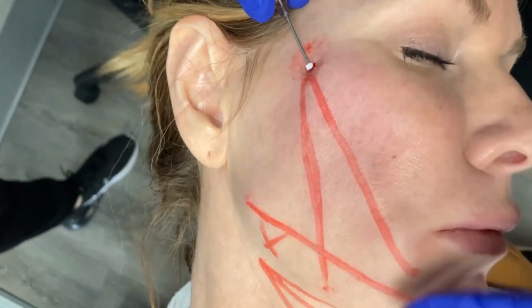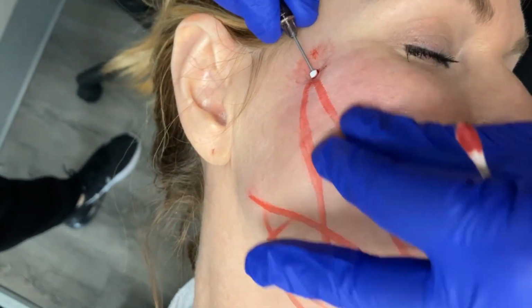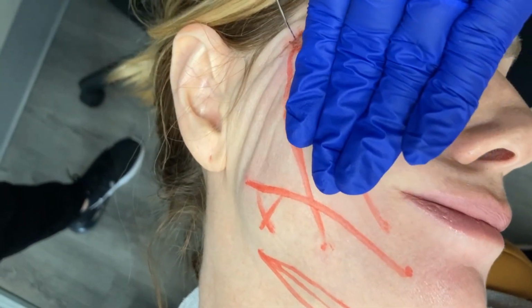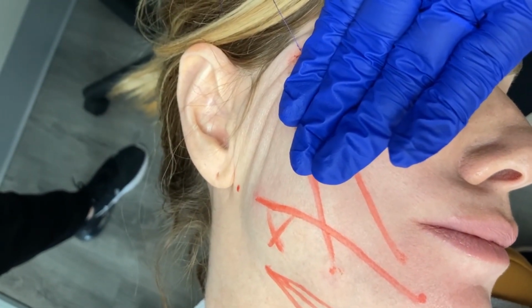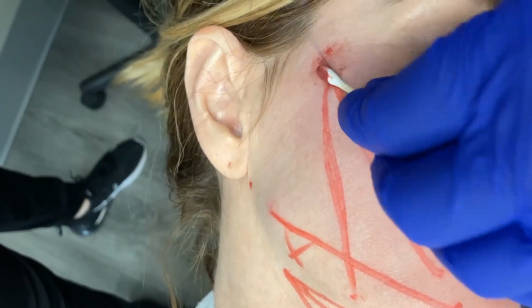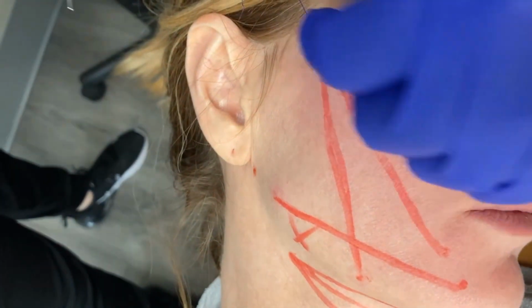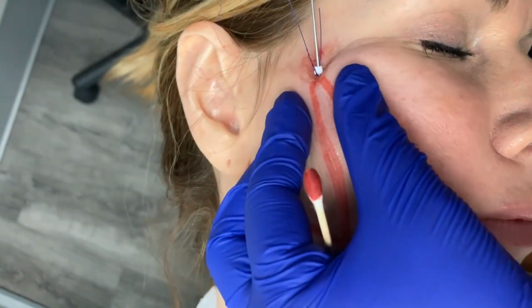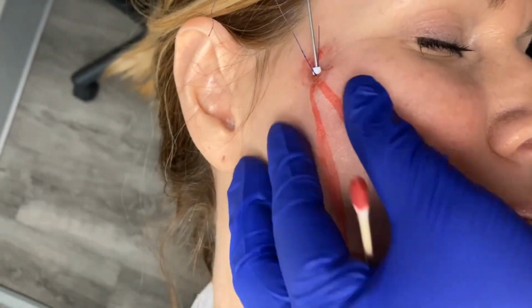Now, as we go in, we're following that tunnel that we just created, using the other hand to go ahead and lift everything over the PDO thread, and then as we come out, we're going to really exaggerate that, as you can see, and really pick that up. And you can see the effect literally immediately here. Now we're going into the second vector. That's all it takes.